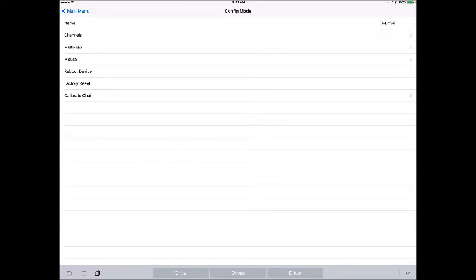and so on. So the factory reset is very effective, because if you think that you've programmed sensor sensitivities, or you've done some stuff on the multi-tap that it just seems odd, something seems like it's not functioning right, if you hit that factory reset, it'll bring it back to just like reinstalling software into your PC, or starting fresh on a PC by formatting the disk. Pretty much what you're doing is formatting the disk to how it came from Stealth, from the factory.